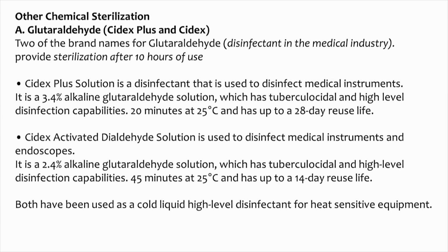You can use glutaraldehyde also. Of course, glutaraldehyde after sterilization will give smell, so you need to have it left out so that all the glutaraldehyde vapor evaporates. There are some brand names for glutaraldehyde, Cidex Plus and Cidex.